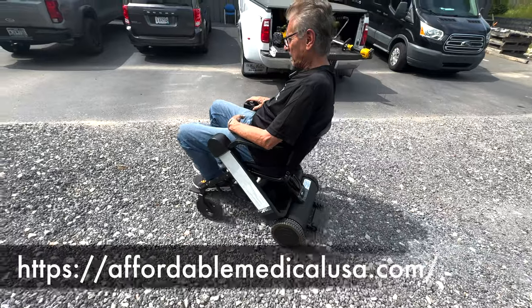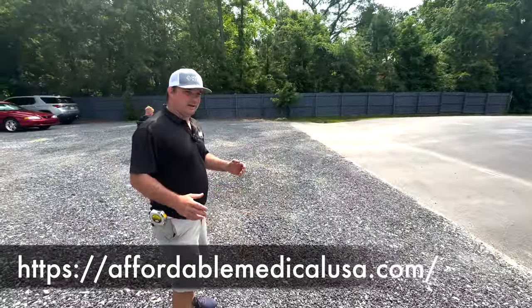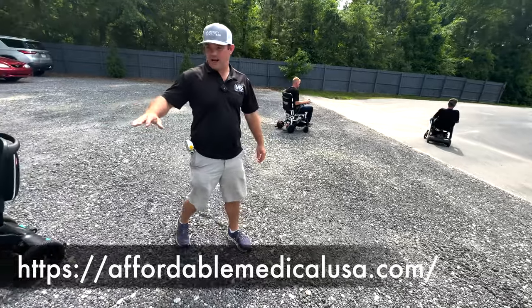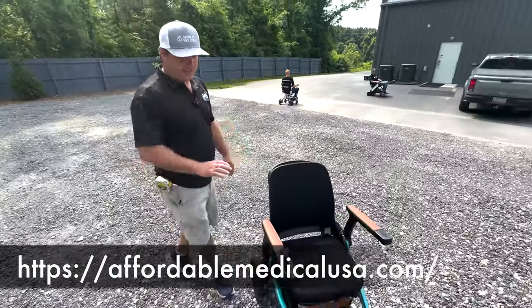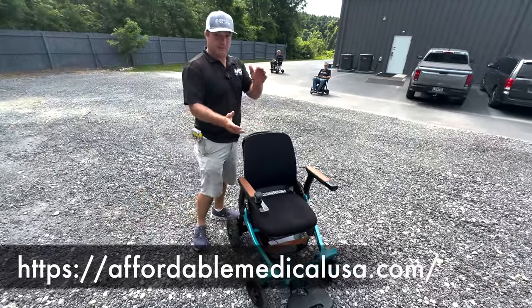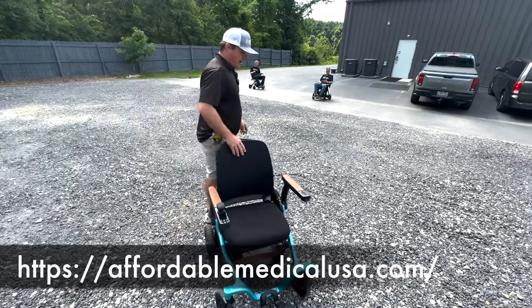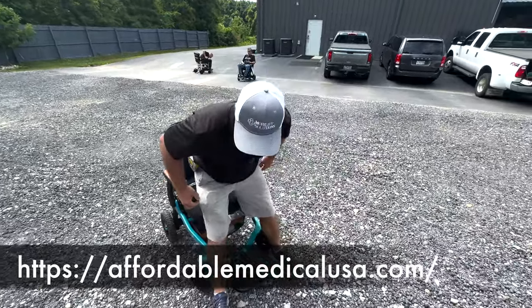You're traveling outside the country. You're going to come across certain places where you need to get up and either pick it up or move it. So we don't like to come out here and show you this stuff riding through perfectly and editing it. I know there's stuff you see on the beach all the time, people riding stuff on the beach. This thing could go on the hard surface beach if the tide's down. But getting out to the beach, if there's not a ramp or some way, it's not. So be careful with falling for some of those videos and tricks to sell you on a beach chair.